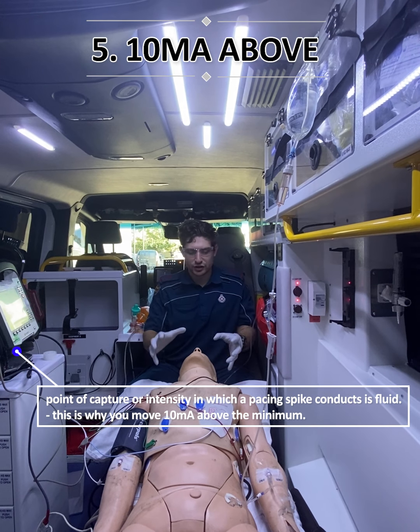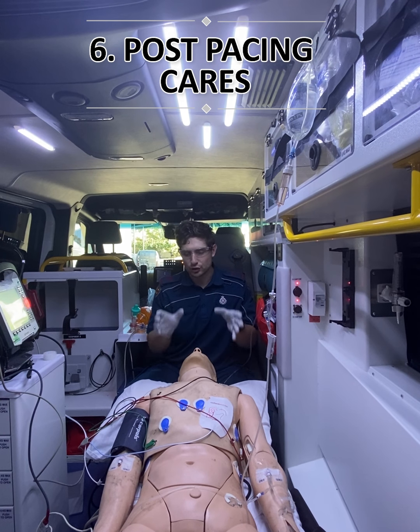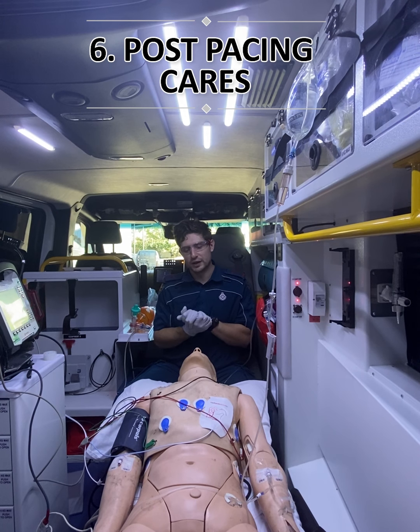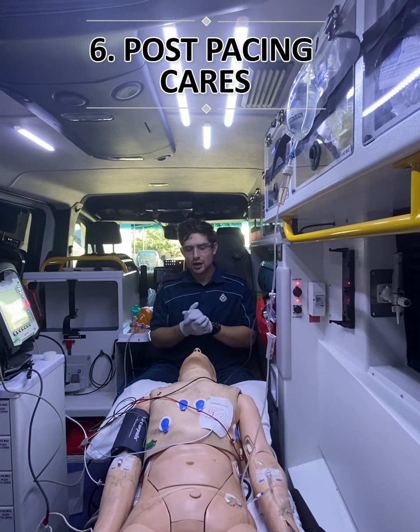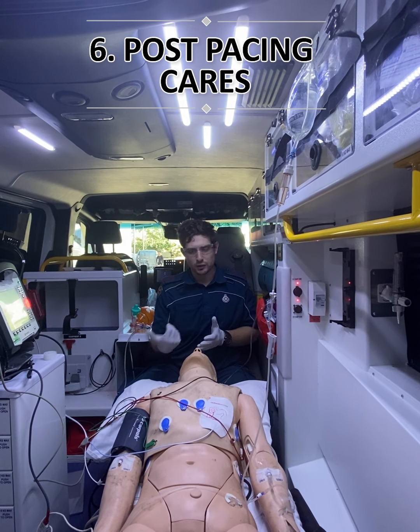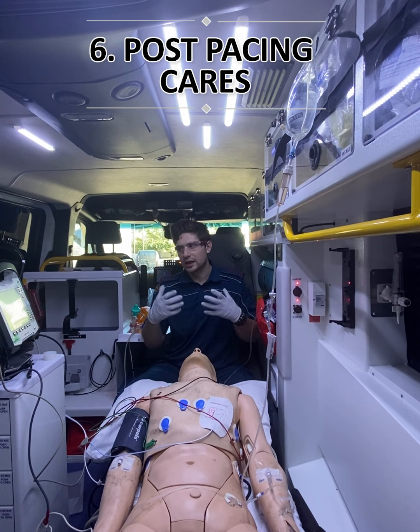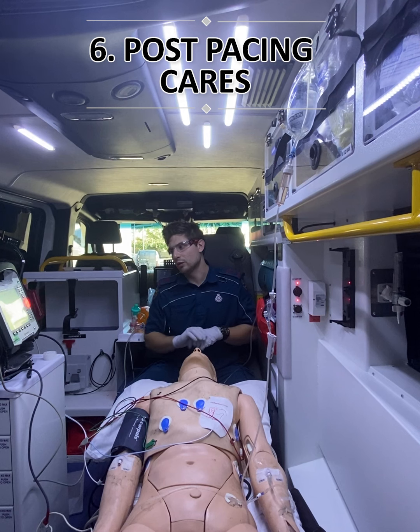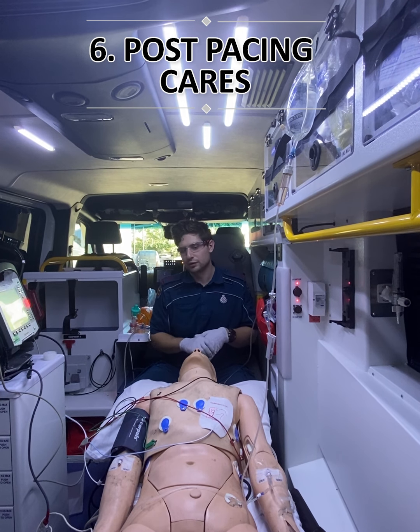We need to be constantly reassessing this patient now we've established our intensity. We need to ensure that they're adequately sedated as well, and there's enough pain relief and sedation on board. Once we have an intensity of 60, say, we need to constantly be reassessing that pulse, constantly reassessing that blood pressure, ensuring that our patient is getting both mechanical and electrical conduction through. And we'll obviously be printing out this ECG to do a double check as well, to ensure that we do have a measure of success.